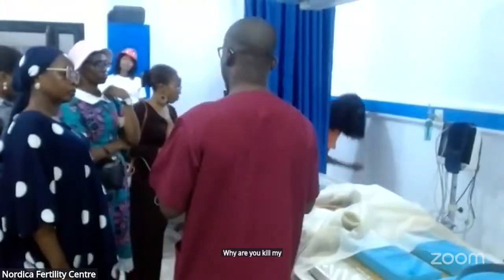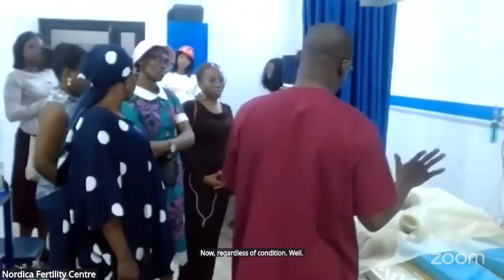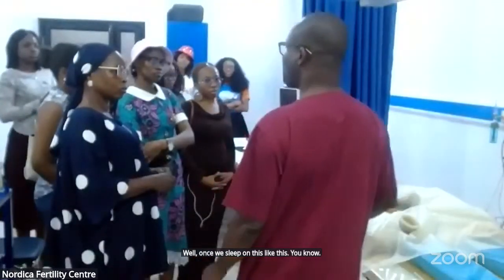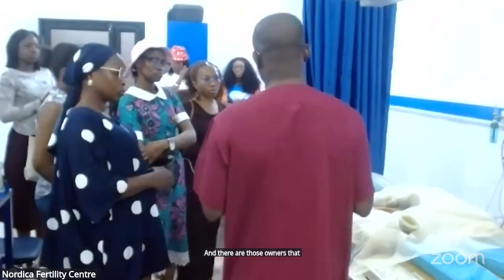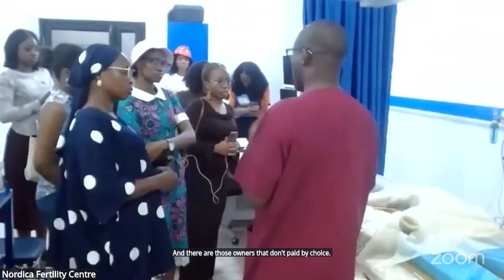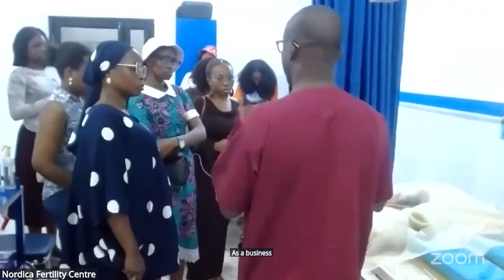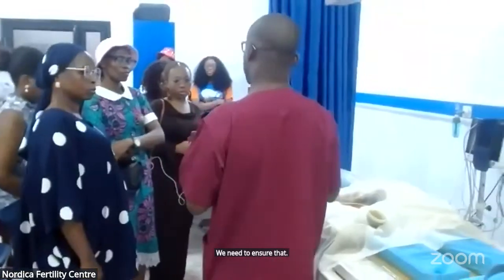Now, it all depends on the threshold of the patient. There are people that once they lie on this, we finish with no sound at all. And there are those whose pain threshold is different. So maybe they are having some discomfort, then we give the medication to make sure that it is as painless as possible.